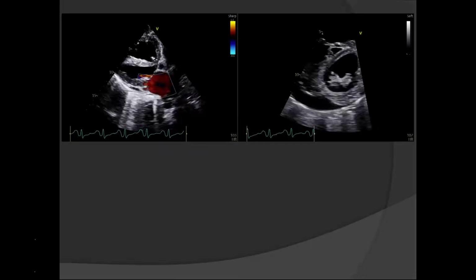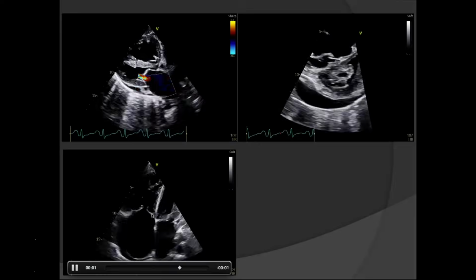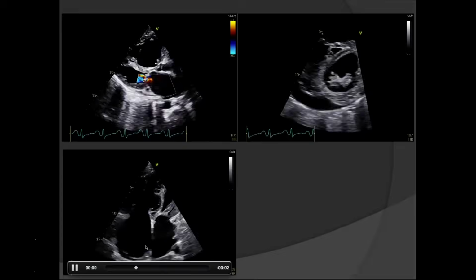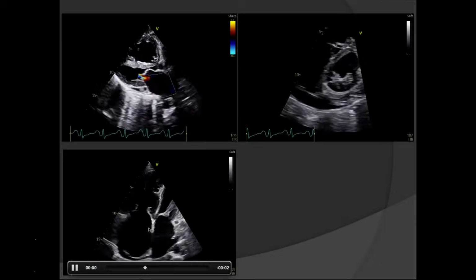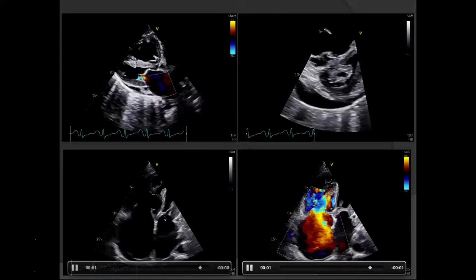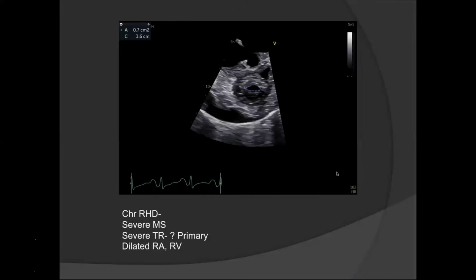So this is just a thinking cap. We should always have this questioning attitude to look at this tricuspid image. Is it tethering and non-coaptation because of the significant pulling apart of chordae, and the annular dilatation that is happening because of RA and RV dilatation, which is causing non-coaptation and high pressure TR? Because it was a high pressure TR and no significant forward gradient was noted, we concluded that this patient does not have rheumatic involvement of tricuspid valve, but it is primarily because of severe MS on the left side that this kind of situation has resulted.